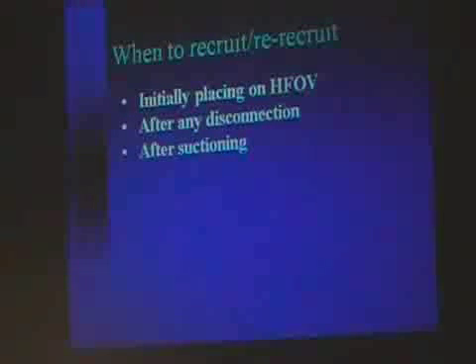A very simple way that we can do, write it in a protocol or something, that will re-recruit that lung to where it was. Of course, you can't walk away and forget it. You have to bring it back down to where it was before. But usually 5 or 10 minutes on 1 to 2 centimeters of higher water pressure will bring that lung back to where it was, then you back down again.